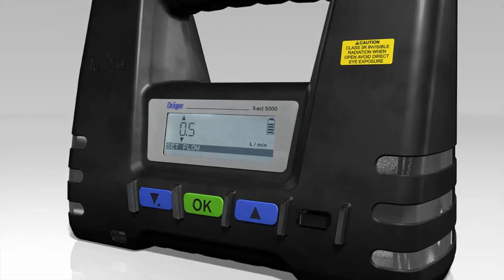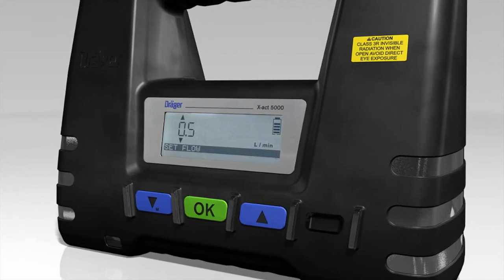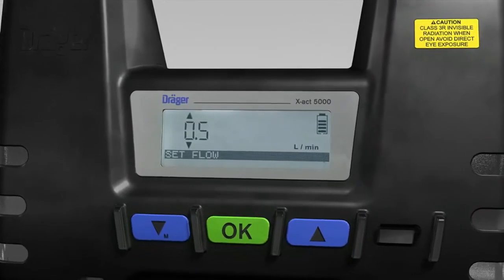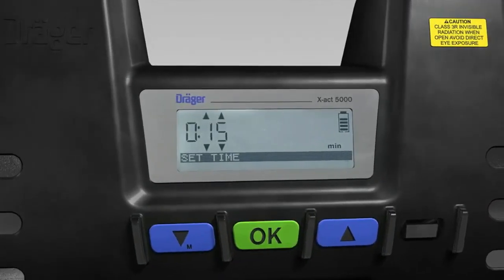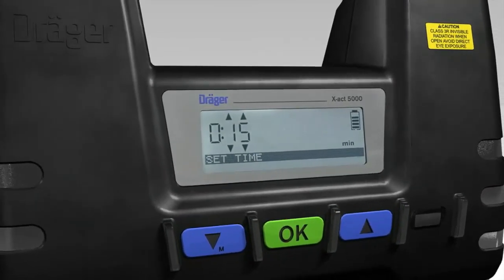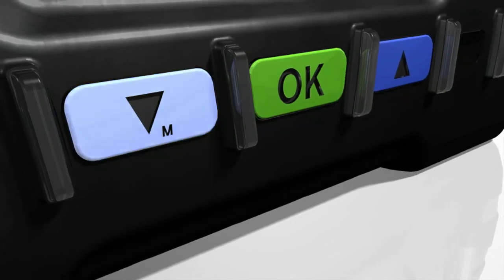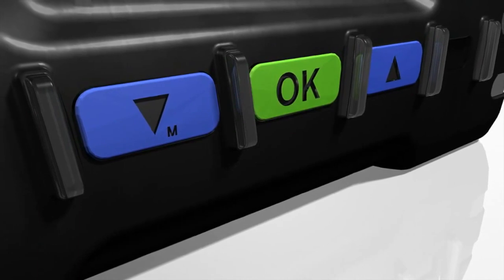The tube pump will now ask you to enter the flow rate. Use the arrow buttons and confirm each decimal place entered by pressing the OK button. You will then be asked to enter the sampling time. Use the arrow buttons and confirm each decimal place entered by pressing the OK button.